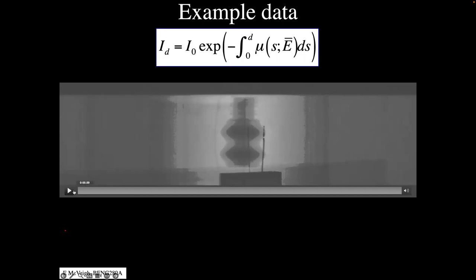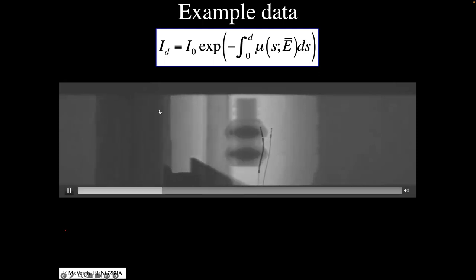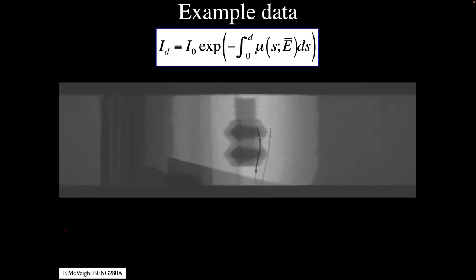What we're going to show here is the true measured raw data from the scanner of that object, without doing any logging or any kind of post-production. At each angular view of the source and the gantry, we get a projection and a shadowgram through that object. I always thought that the raw data that comes out is actually the sinogram from the CT. Is that not the case?